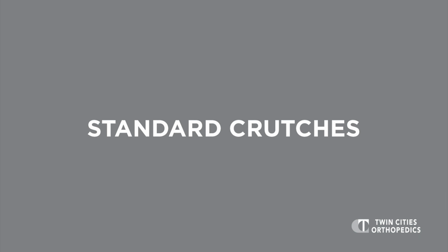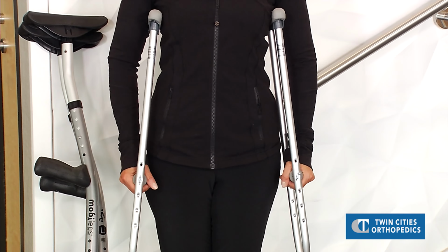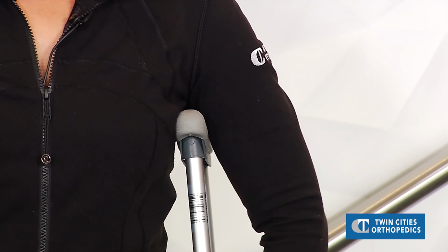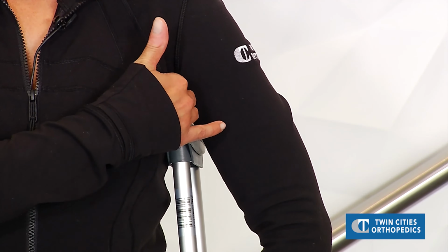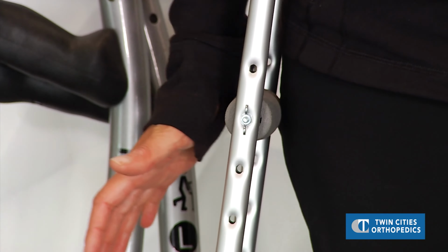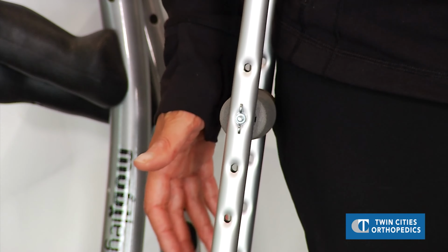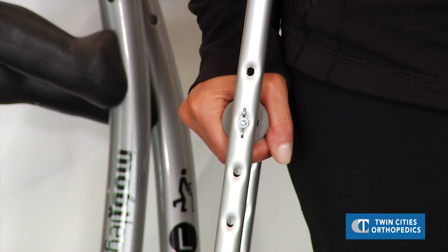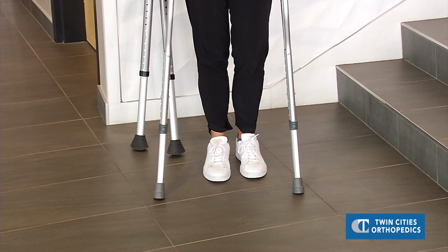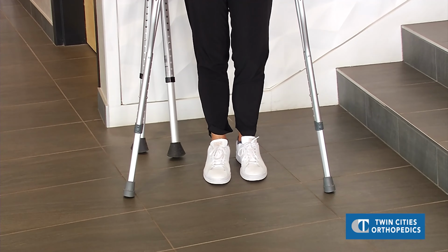For the tried and true standard crutches, make sure to stand tall with your arms by your side. Adjust the length of the crutches so that the top of the crutch again is that 2 to 3 finger widths from your armpit to the top of the crutch. And the hand grips should be right at your wrist creases. Adjust the hand grips so that your elbows will be slightly bent at about a 30-degree angle. The bottom of the crutches should be wider than the shoulder width.